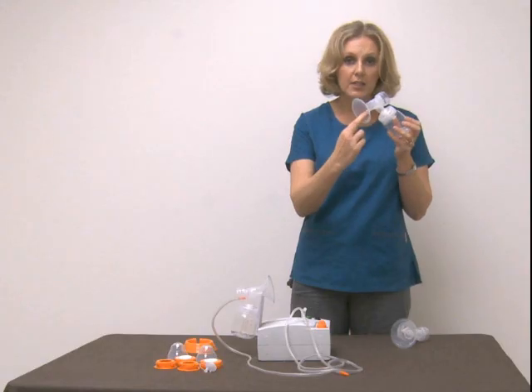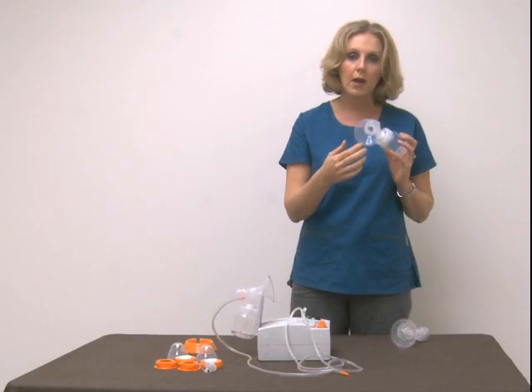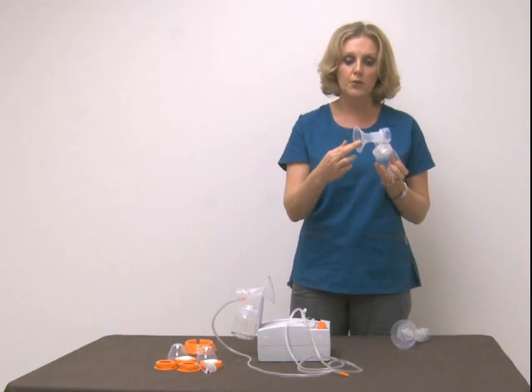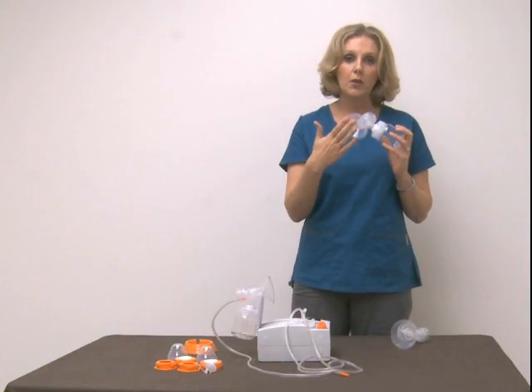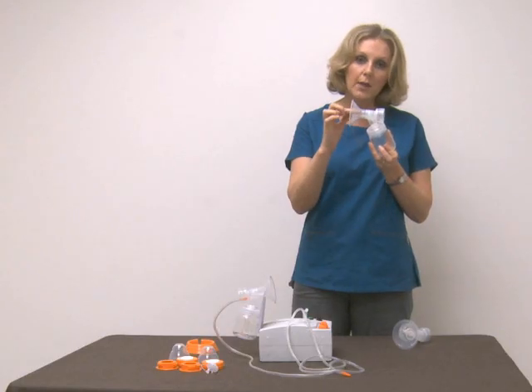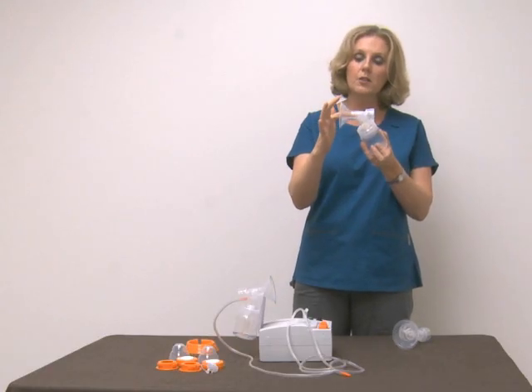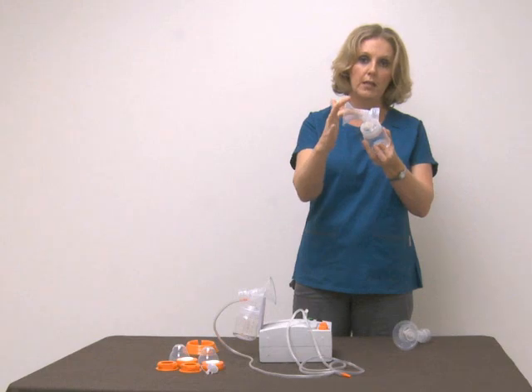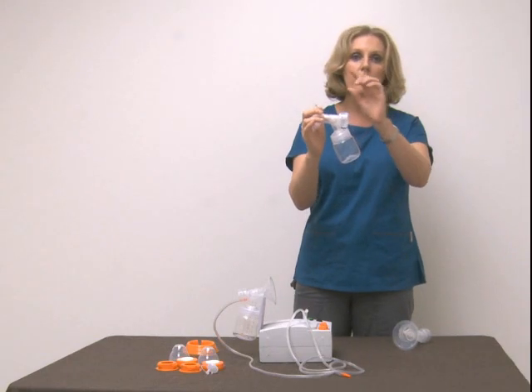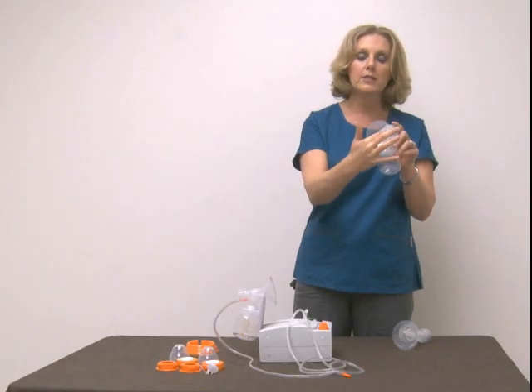There's no industry standard for flange sizing. So if you're using a different manufacturer's flange or breast pump and coming over to Hygieia for the first time, it may be different with our products. Some manufacturers will measure and call it a 27 or a 29, but there's no industry standard for where they measure it in the tunnel. We simply call ours medium, listing 27 to 29, and that variation depends on where in the tunnel you measure.